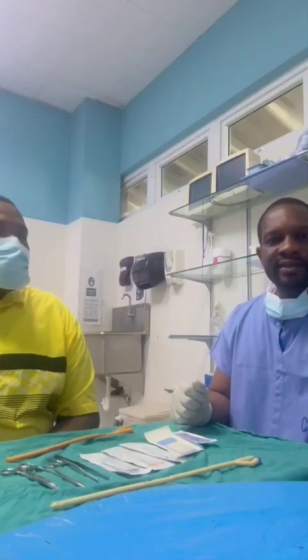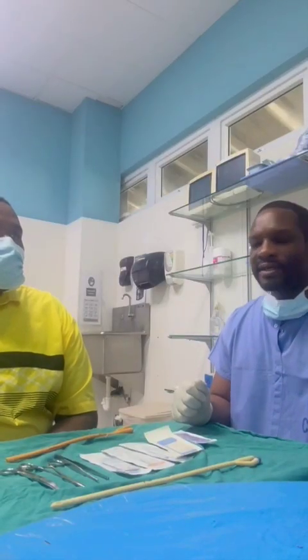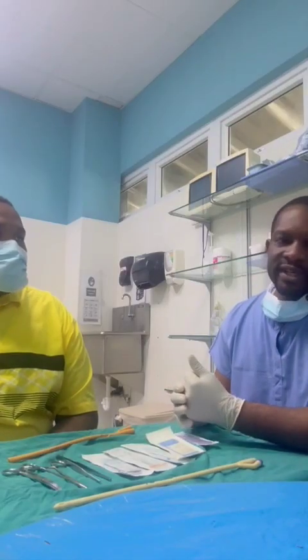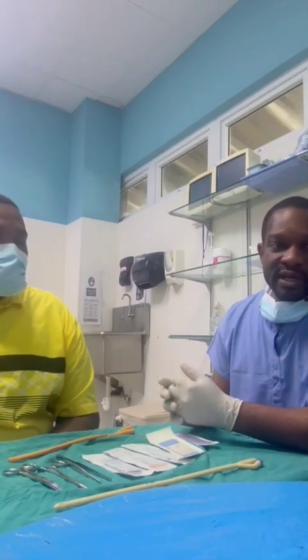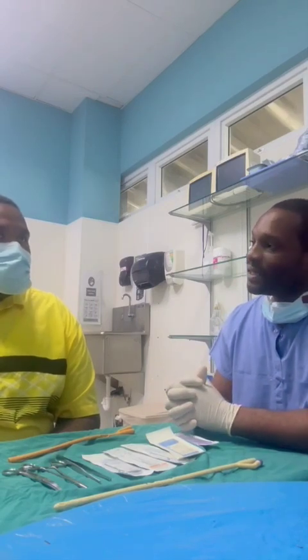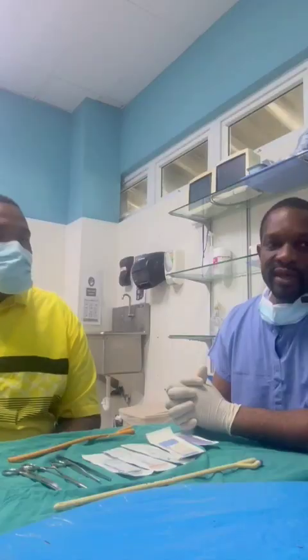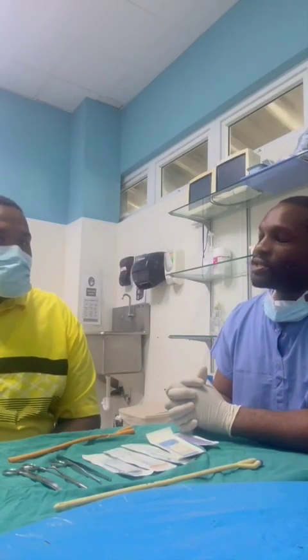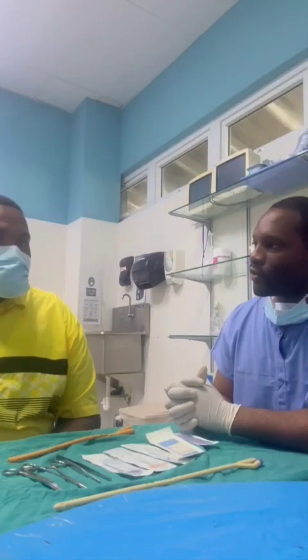So in today's session, I have three main objectives. I would like you to perform continuous sutures with a needle and needle holder at a rate of at least three stitches per minute for 1 minute.